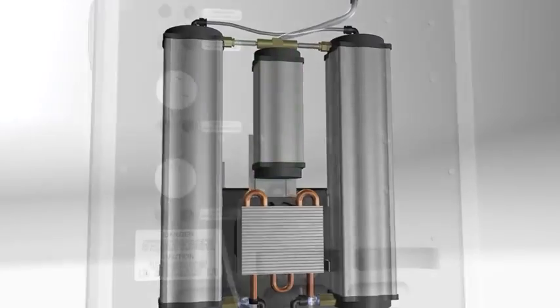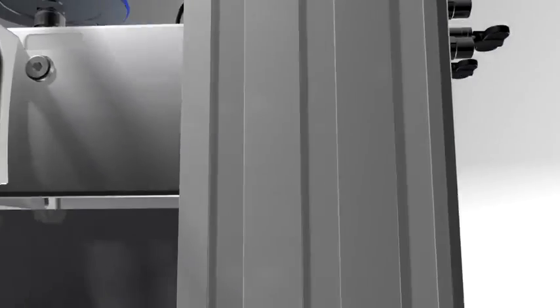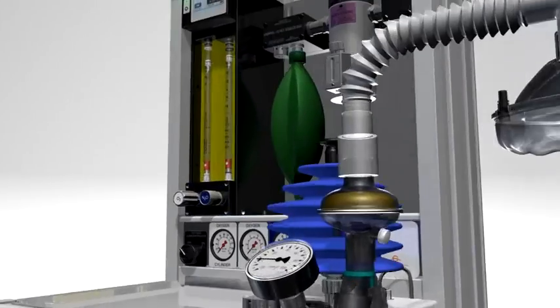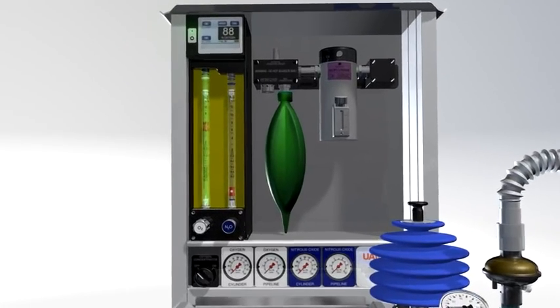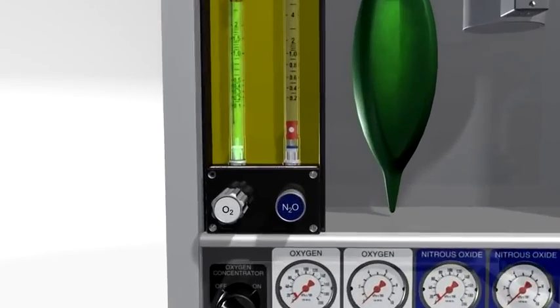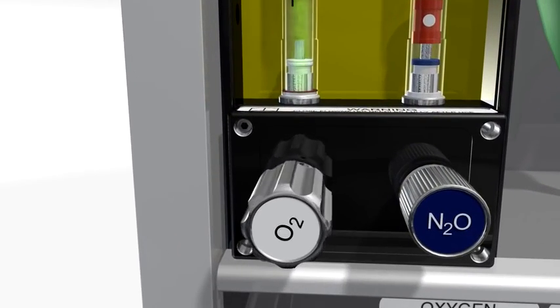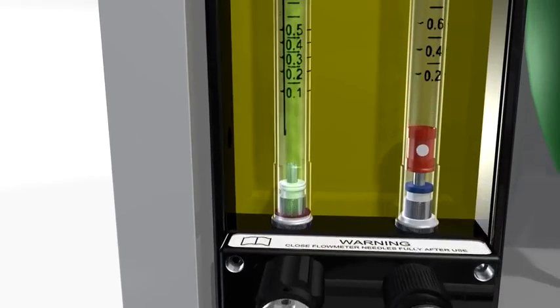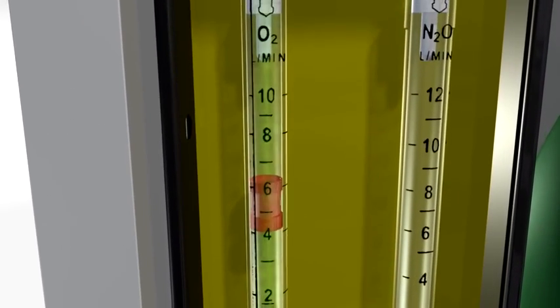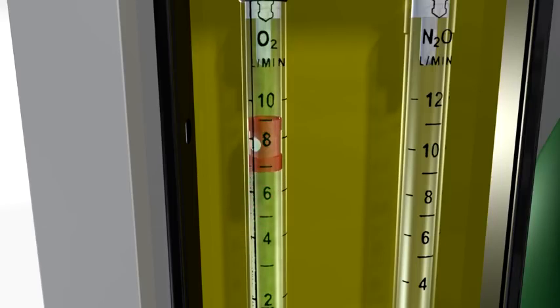The UAM produces up to 10 liters per minute of oxygen. The oxygen then travels through the flow meter into the back bar and reservoir bag. The flow meter controls the amount of oxygen entering the back bar and available for the patient. The spinning bobbin shows the flow rate in liters per minute.